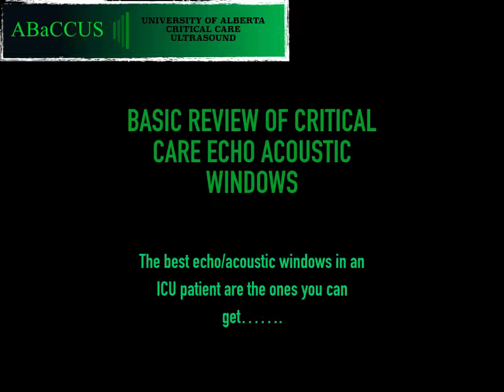And I always say the best windows in an ICU patient are the ones you can get. This is often the case because sometimes you can't move patients. They can't be moved to a lab or to a CT scanner, or you can't move them in the bed at all. And so the nature of critical care ultrasound is about being opportunistic. In some cases you may not get any windows at all, but it's really learning how to exploit those windows in patients with certain conditions. For example, on patients who are mechanically ventilated, oftentimes the subcostal or subxiphoid window can be a very useful and accessible window, and it's also very fast.